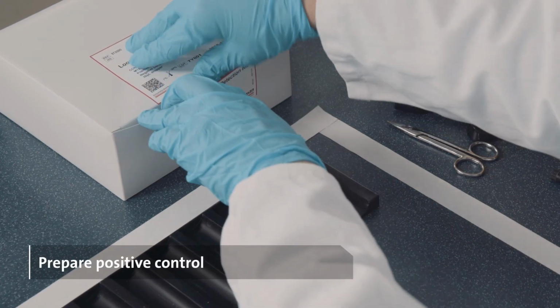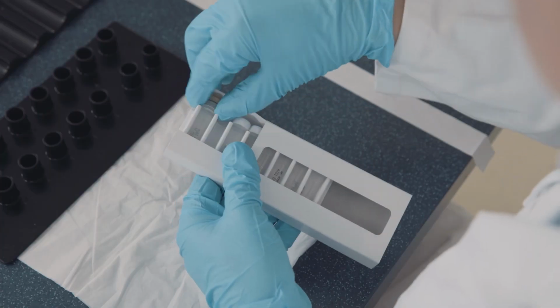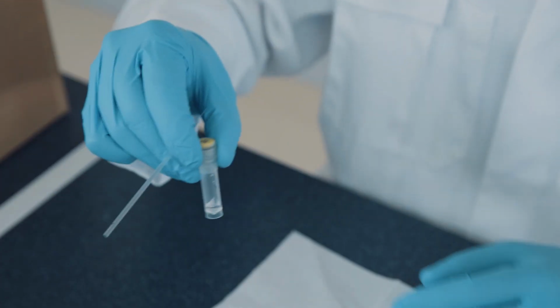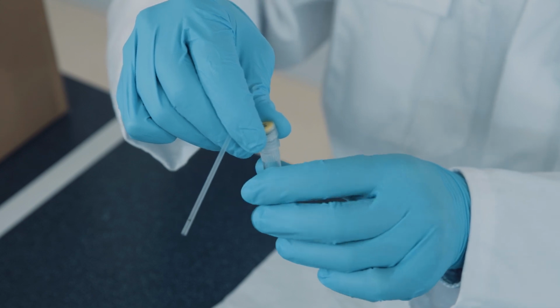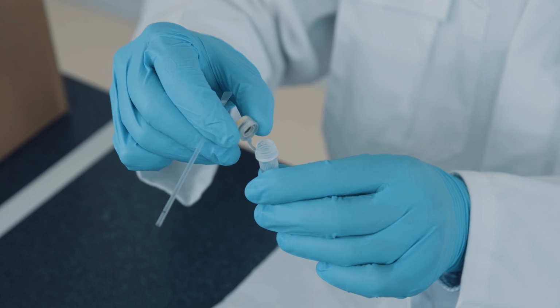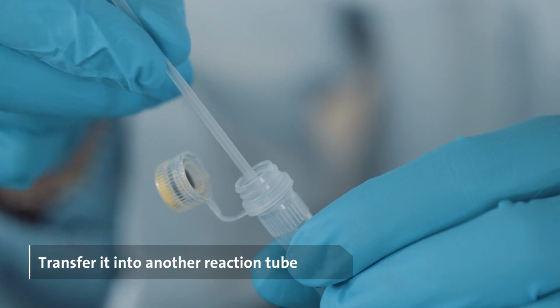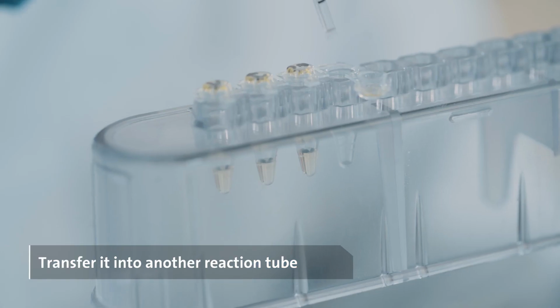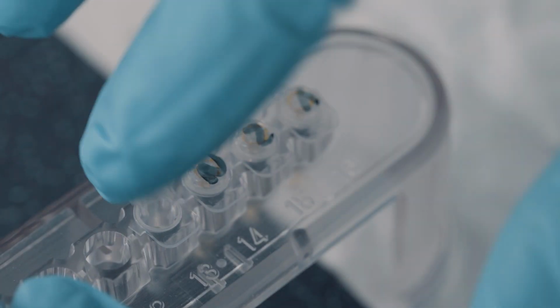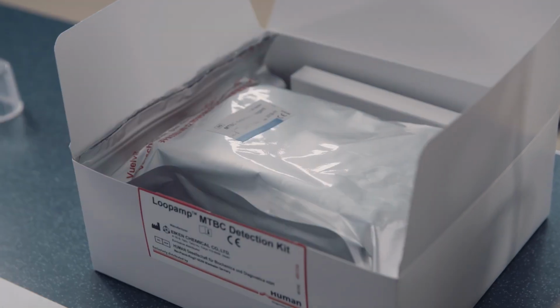Now prepare a positive control. Take out the droppers and the positive control from the Loopamp MTBC detection kit. Shake off the tube with the positive control one time to remove the liquid from the cap. Do not touch the cap of the positive control to avoid contamination. Transfer 30 microliters of the positive control with the help of the dropper into the respective reaction tube. Put the positive control back into the box.